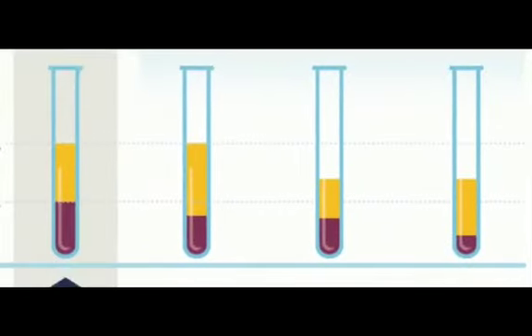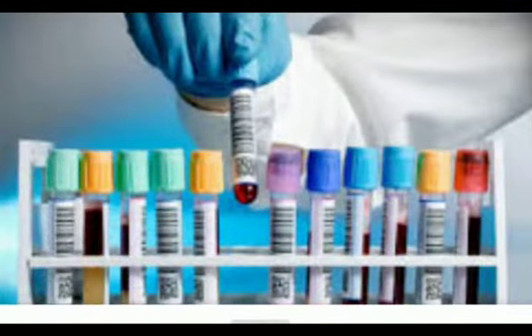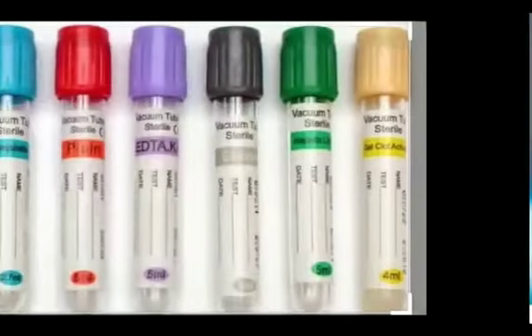The volume of the blood and the site of puncture are determined according to the analysis type and the number of analyses. The sample should be treated or not according to the type of the test. Generally, the main types of blood sampling are arterial sampling, venipuncture sampling, and finger stick sampling. The most common one of these is the venipuncture sampling.